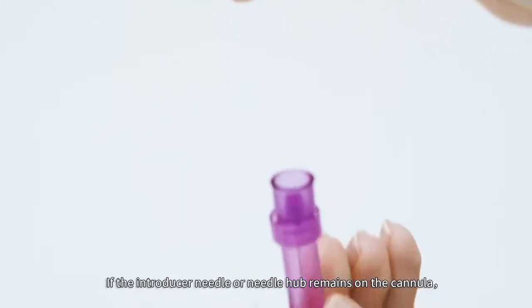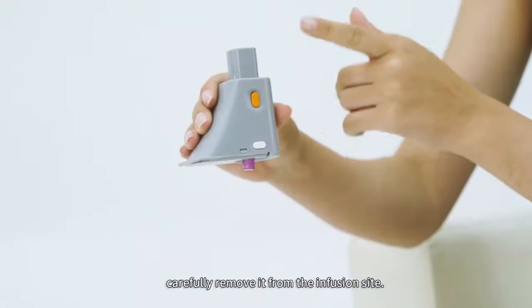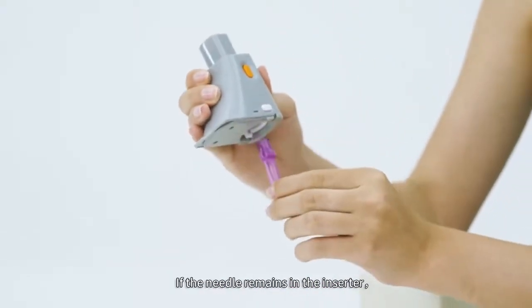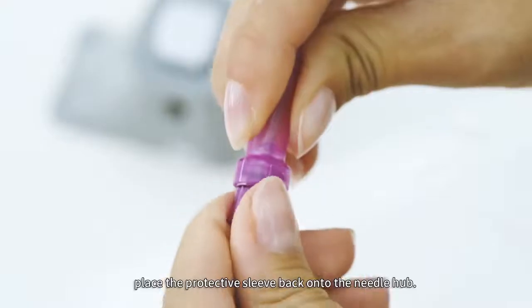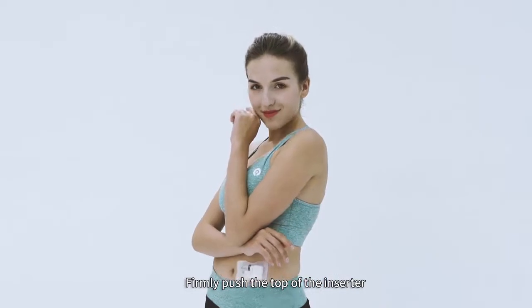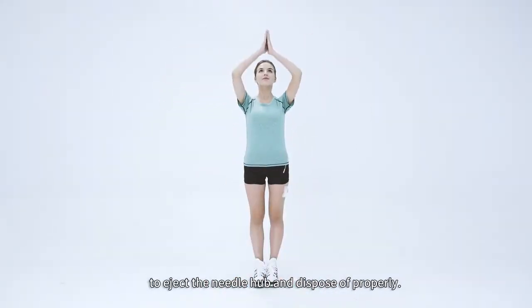If the introducer needle or needle hub remains on the cannula, carefully remove it from the infusion site. If the needle remains in the inserter, place the protective sleeve back onto the needle hub. Firmly push the top of the inserter to eject the needle hub and dispose of properly.